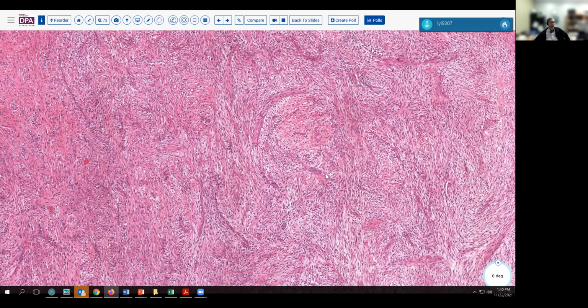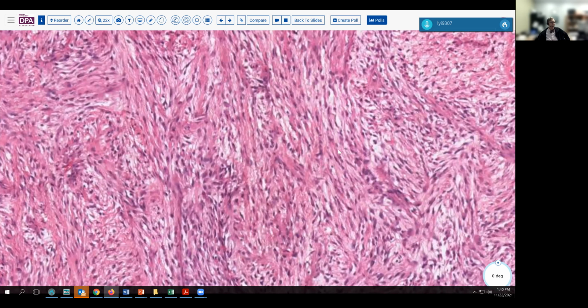You'd have a hard time finding mitoses in this tumor. It's certainly a grade 1 tumor. And usually can be managed with local excision. Recurrences do occur. This is most frequent in the sort of early adulthood to early middle age category.